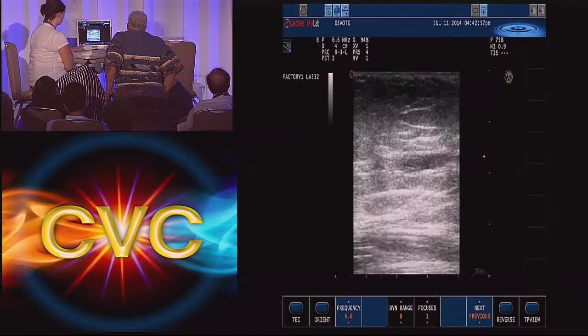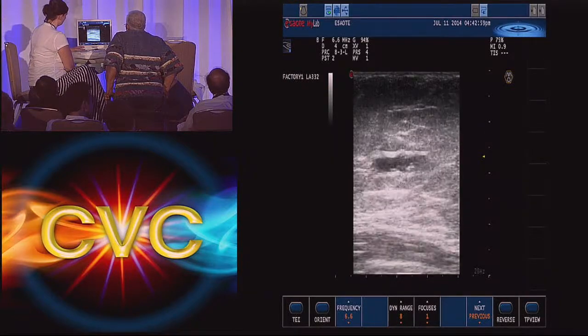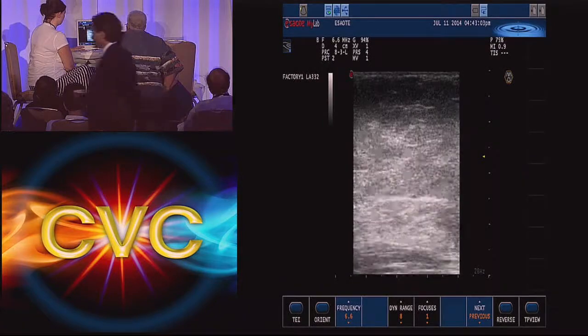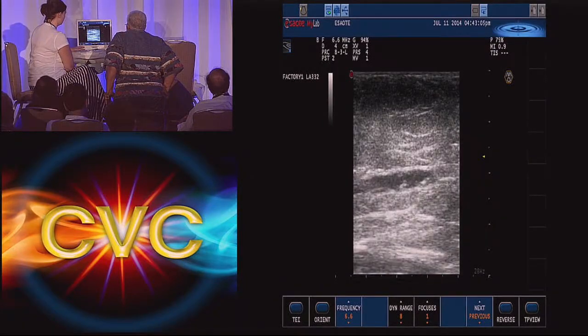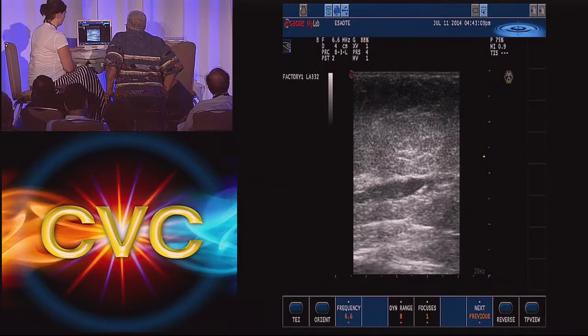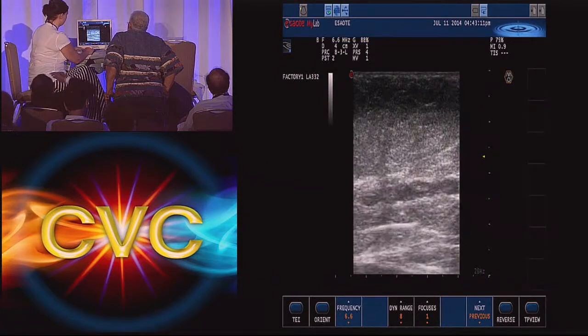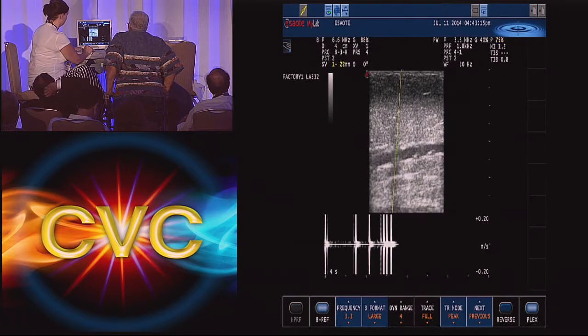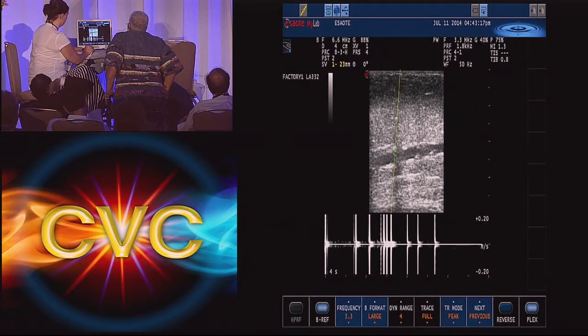Yeah, so sometimes she's had an ultrasound before and you know there's reflux, but the room is cold, and that changes the pattern. So at that time, you have to rely on what the patient's symptoms are. And you know that the finding for now is different. You'll do it at another time, or you'll change the temperature in the room and figure that out.